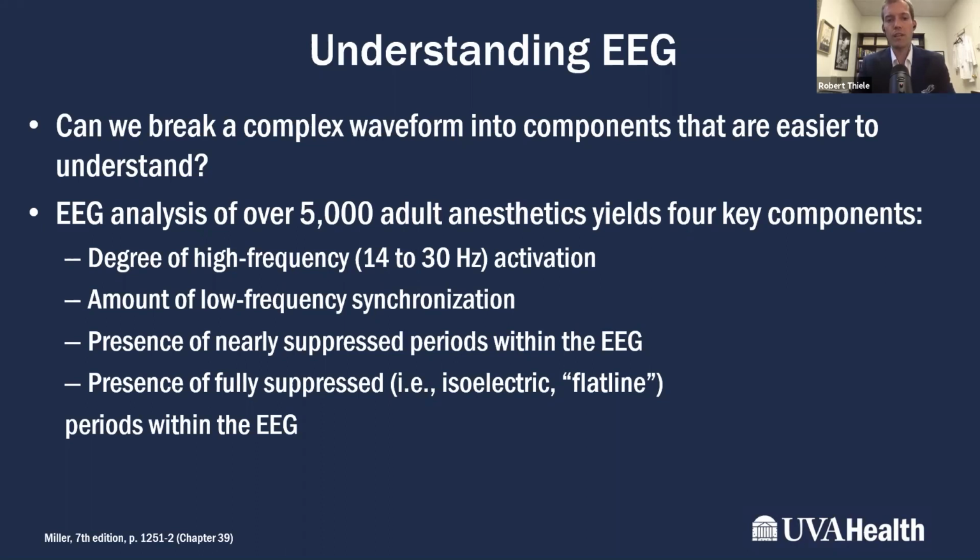One was the degree of high frequency activation. That's the amount of the EEG waveform that's oscillating at a pretty high frequency, so 15 times a second. The amount of low frequency synchronization. So that's if you take the waveforms that are occurring at a lower frequency, are they synchronized? Are they in phase or are they out of phase? And then nearly suppressed periods and fully suppressed periods. And when I say suppressed, we're talking about a flat EEG tracing, so very little electrical activity.